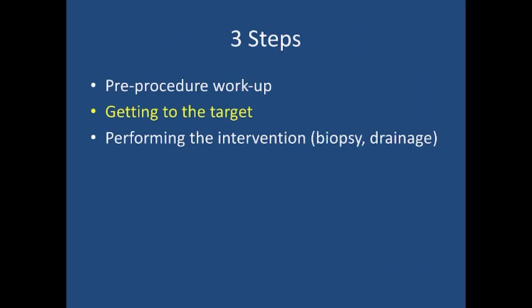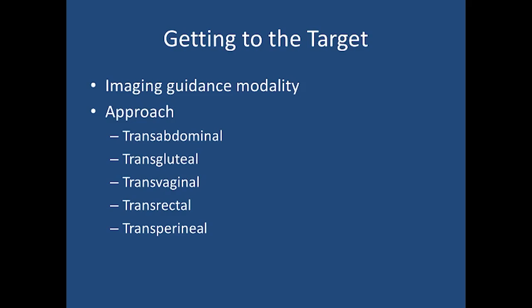The second step in a biopsy or drainage procedure would be getting to the target itself, and that can be broken up into 2 parts. First is choosing the imaging guidance modality to guide the intervention, and second, choosing your approach.